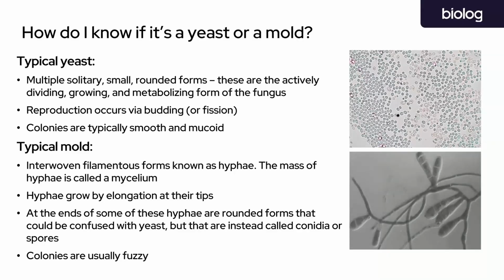And so doing phenotypic ID really has some advantages here of not having to worry about can I extract the DNA or purify anything else from the culture. All you have to do is make sure that your organism is growing. Right, so you don't have to worry about breaking open the cells, extracting anything. It's just looking at the living, growing cells.